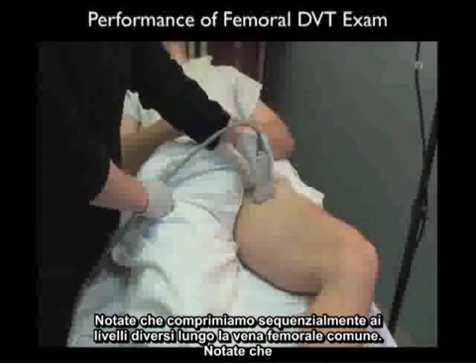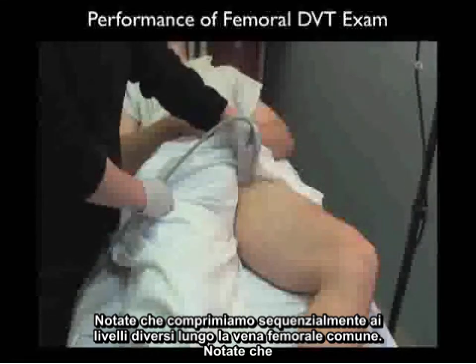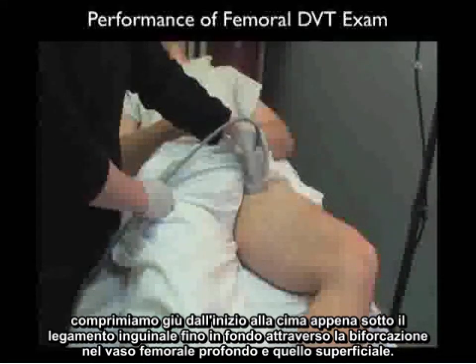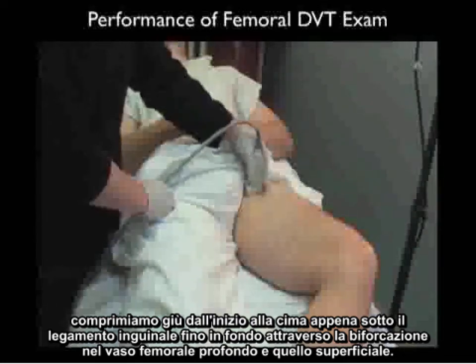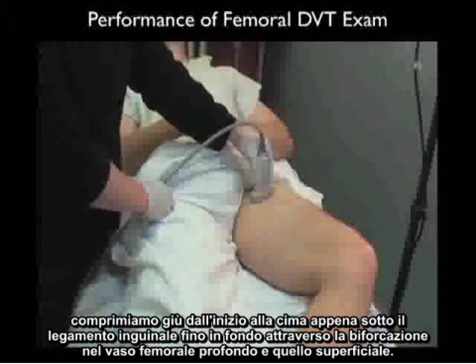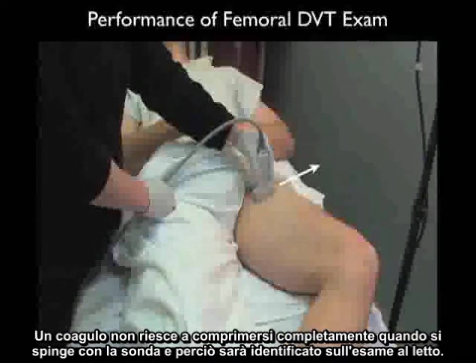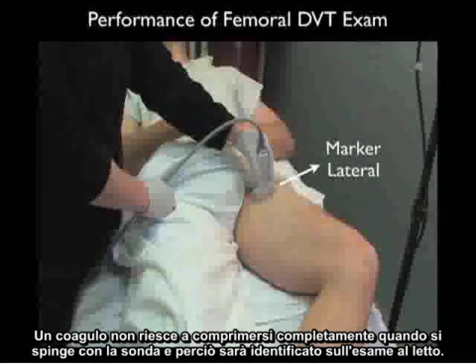Notice that we're sequentially compressing at different levels along the common femoral vein, compressing from the top just below the inguinal ligament all the way down through bifurcation into the superficial and deep femoral vessels. A clot will not completely compress with pressure down with the probe and thus will be identified on bedside examination.